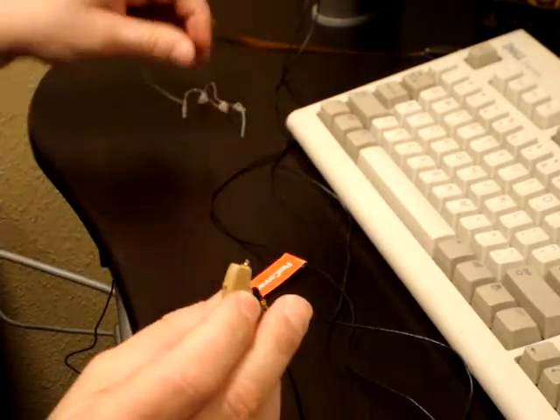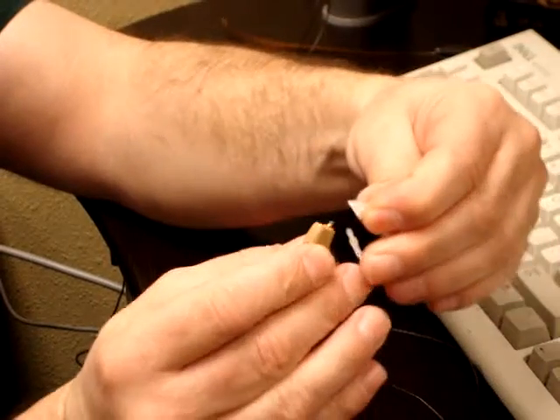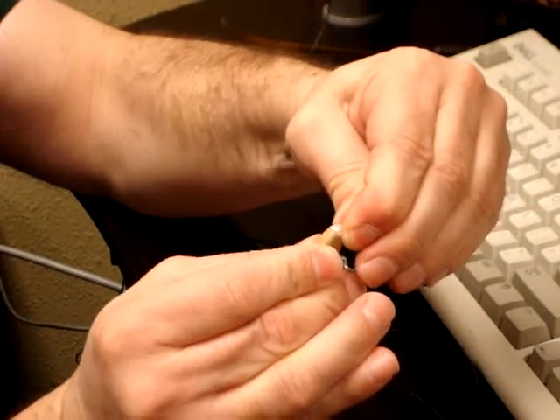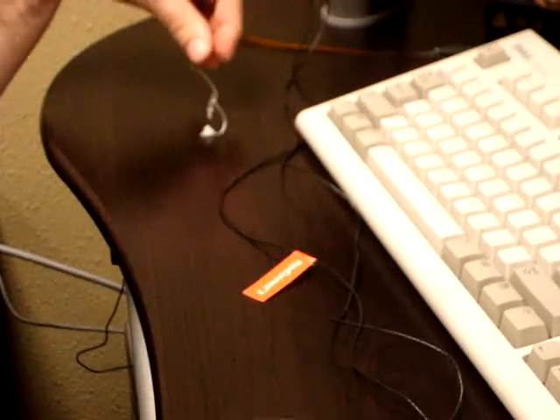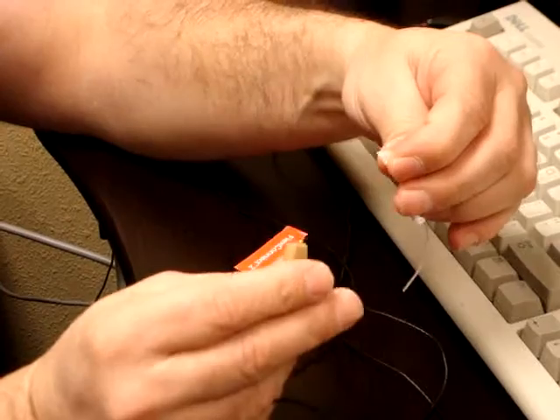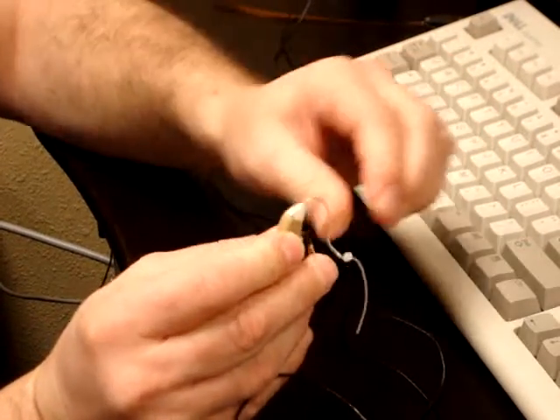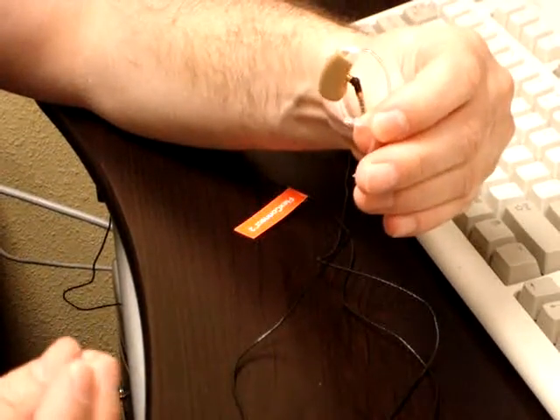Attach a sound tube. Just push straight on. Attach the tulip tip.